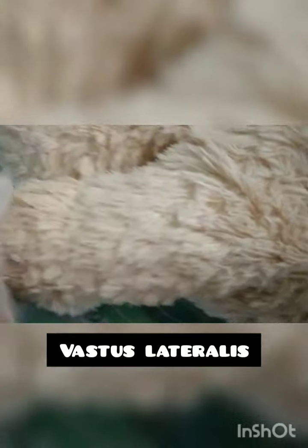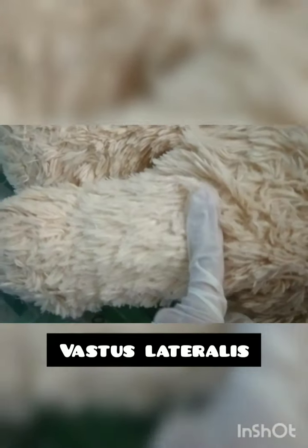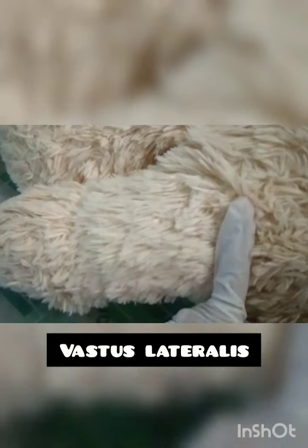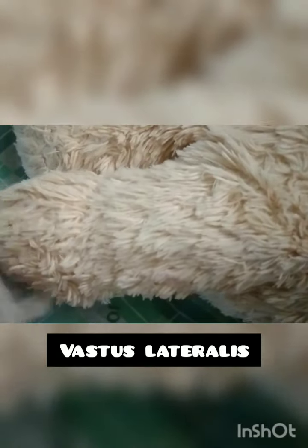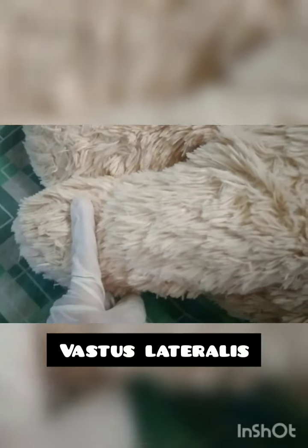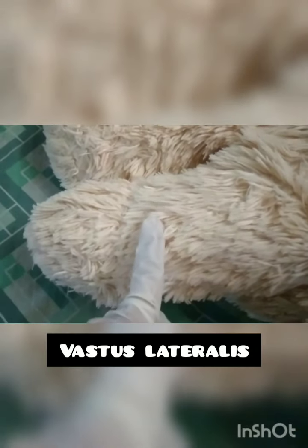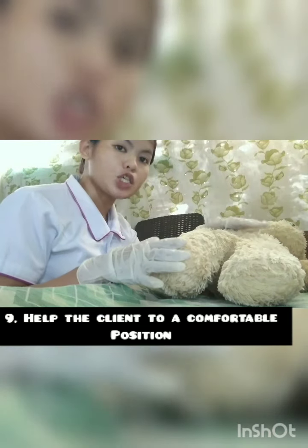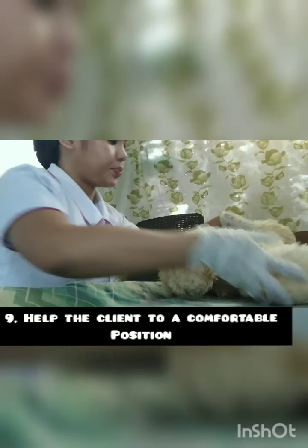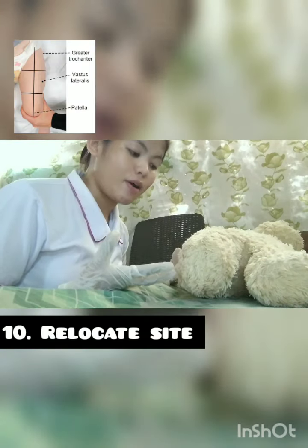So since we are going to inject in the vastus lateralis of the infant, we have to divide the site into 3 parts or thirds, horizontally and vertically, and administer the injection in the outer middle third. So like this, we have to divide it and the injection site would be here. Help the client to place on a comfortable position. Relocate the site using anatomic landmarks.